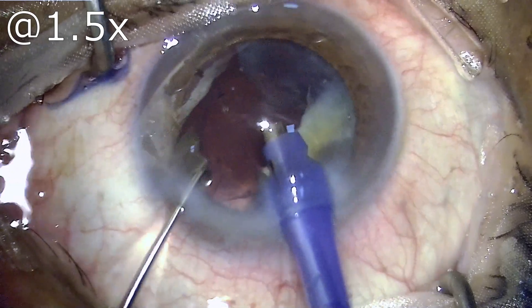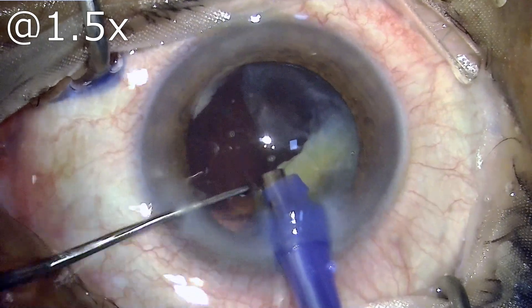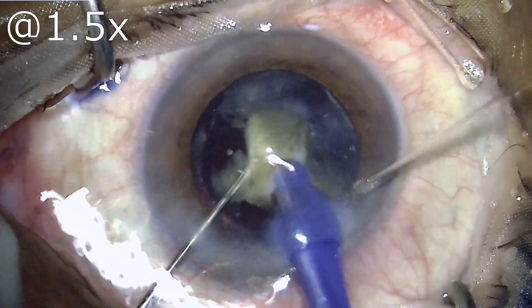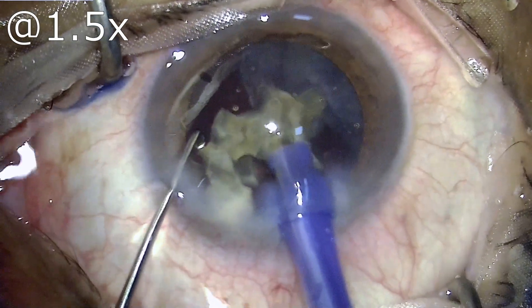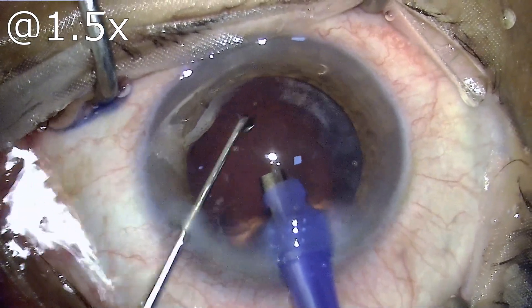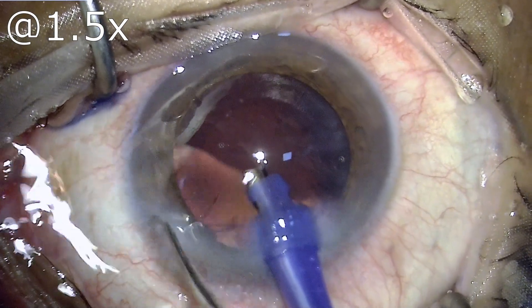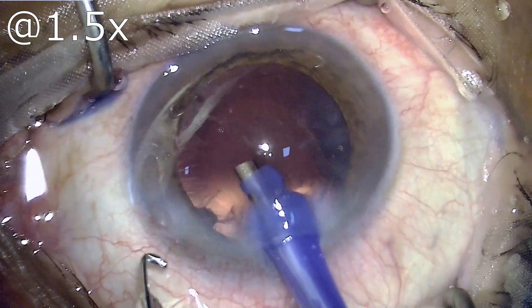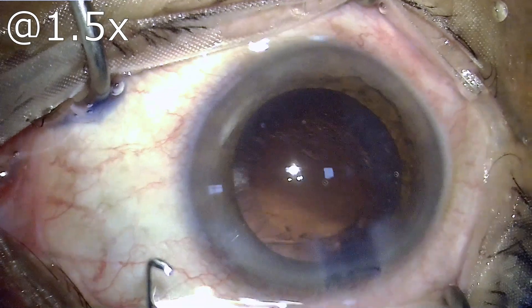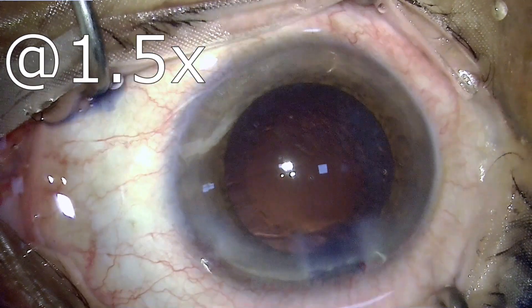As you can see, I have first chopped this nucleus into a total of six pieces, and now as I proceed I keep chopping them into smaller chunks so that they don't reach up to the endothelium. Once I have removed the nucleus, which was actually the bulk of the cataract in this patient, there is hardly any cortex left.